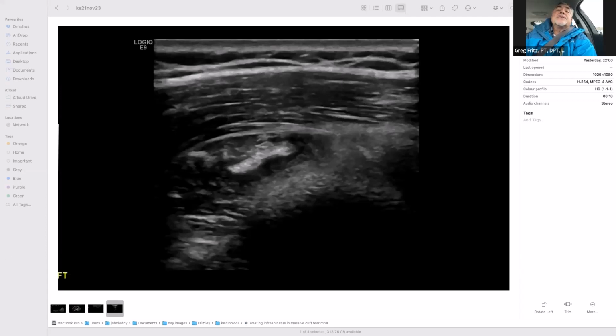Even though there's a tear, that muscle is certainly still giving good effort to keep the cobwebs of fat out of there. So this is very valuable to me. I do like to look at the muscle, and it's just part of the story.